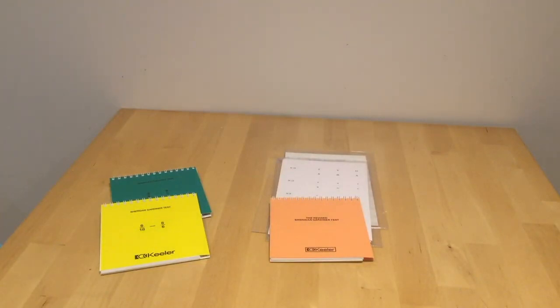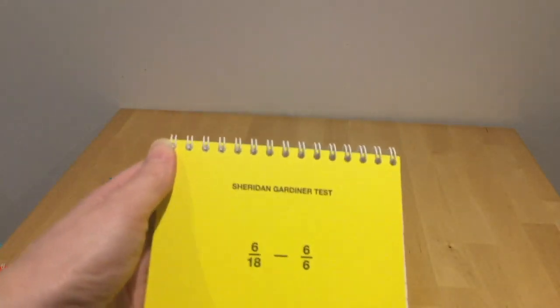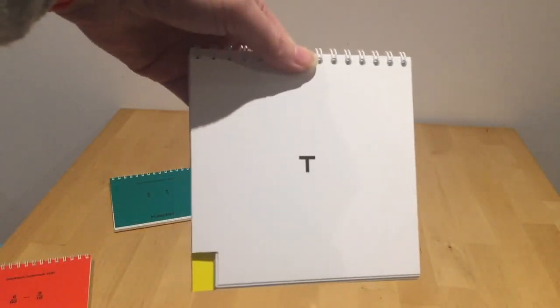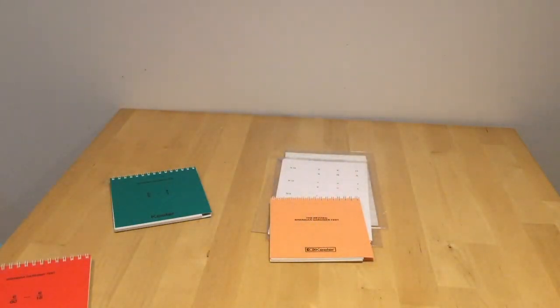If you have everything correct there, going well, we then move on to the next book, the yellow book, and we've got the values at 18. Well, let's have X, and there we go, and so on down to 6, T at 6. There we are. Now remember, if you're doing this at 6 meters and they can read all the letters at value 6, then they have perfect vision.